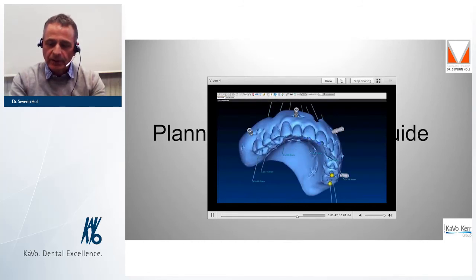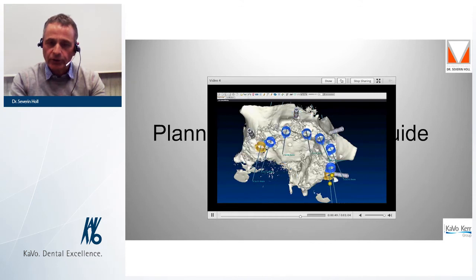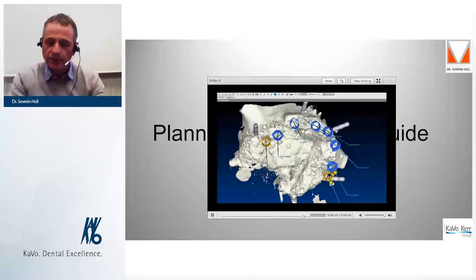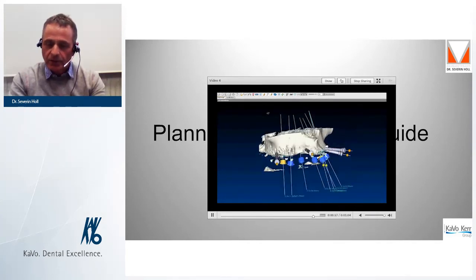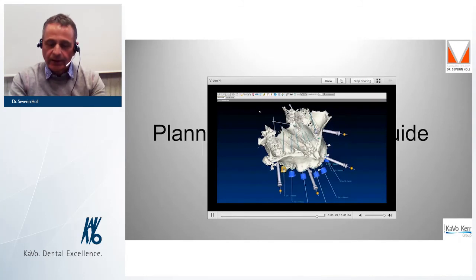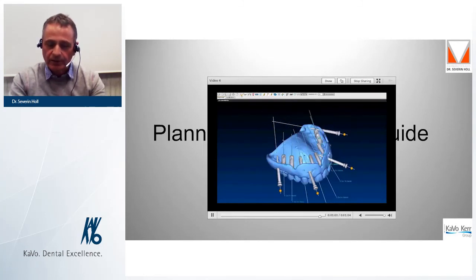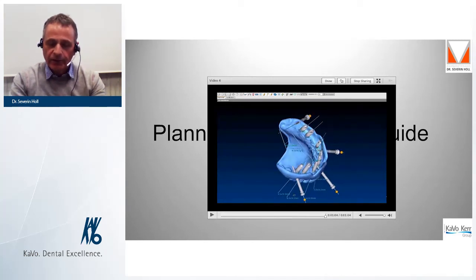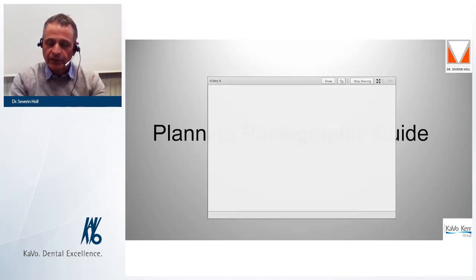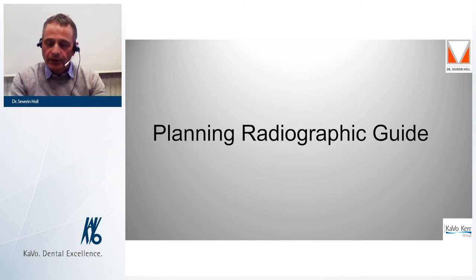The sleeves to attach the template on the jaw, you can see the colored drill sleeves and the anchor pins. Once again, the complete planning result. After planning, we can carry out the treatment of the patient and show you the clinical procedure.